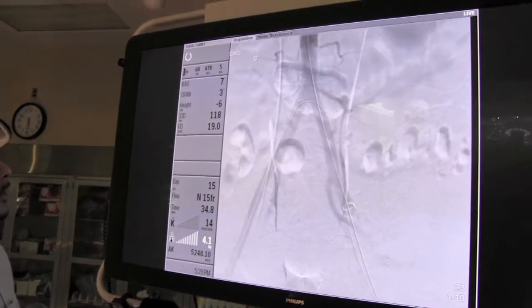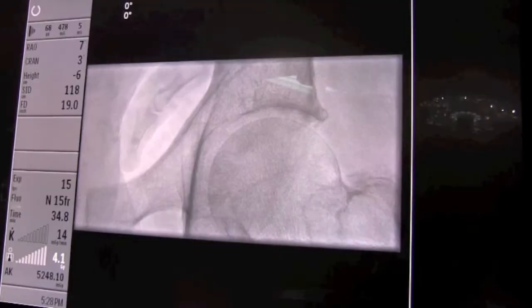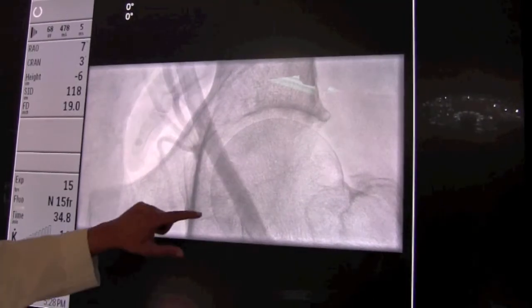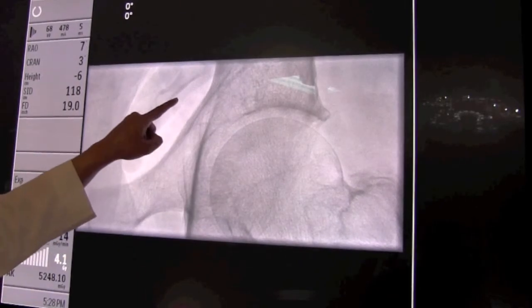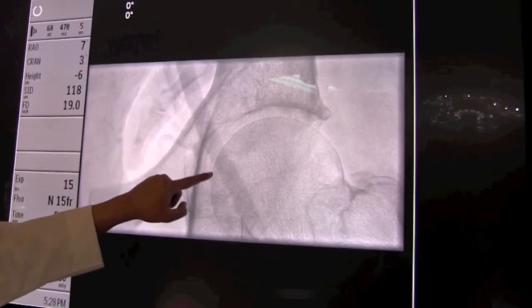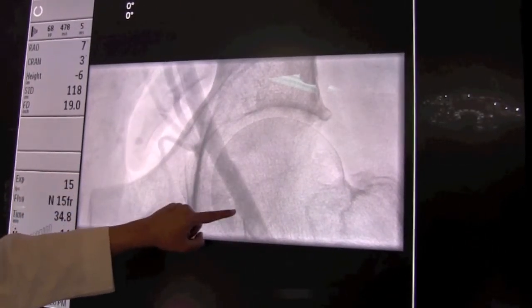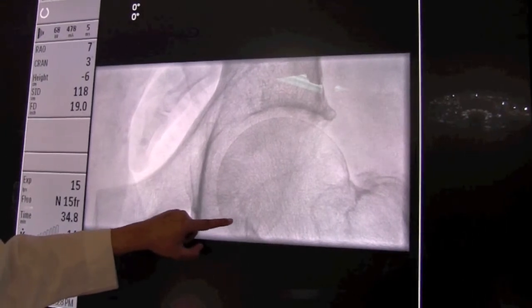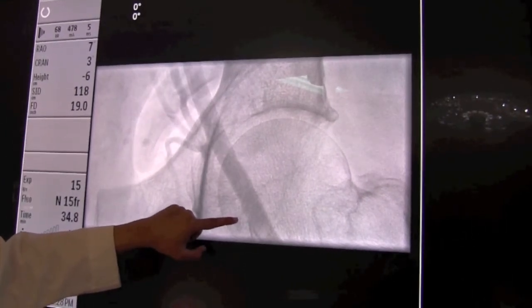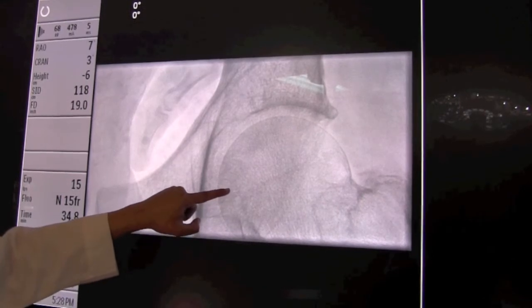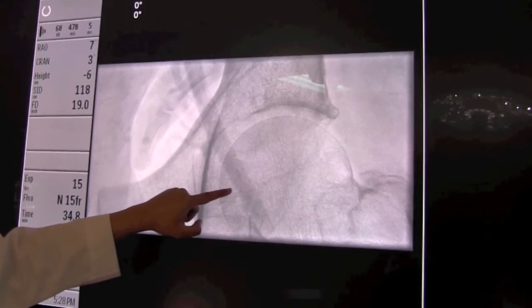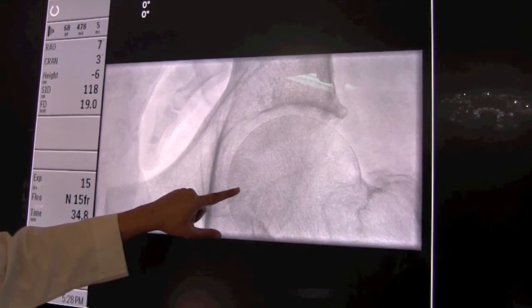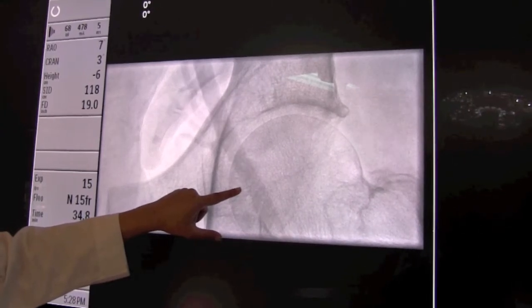So we'll turn our attention to the big screen here. Initially, as you saw, we obtained access in the left femoral artery. When we inject from the other side you can see the artery filling with contrast, and that's our little needle coming in. We spend a considerable amount of time getting just the right position in this artery because this is where the very large sheath or plastic tube is going to go in.